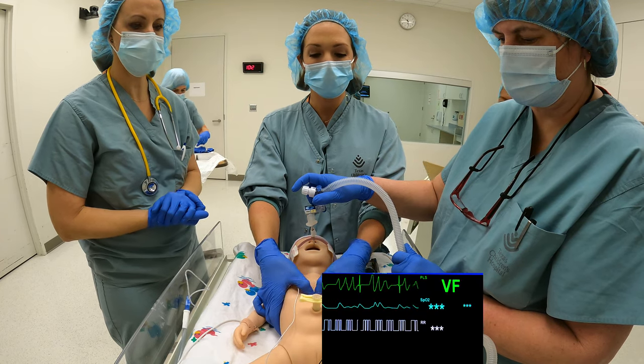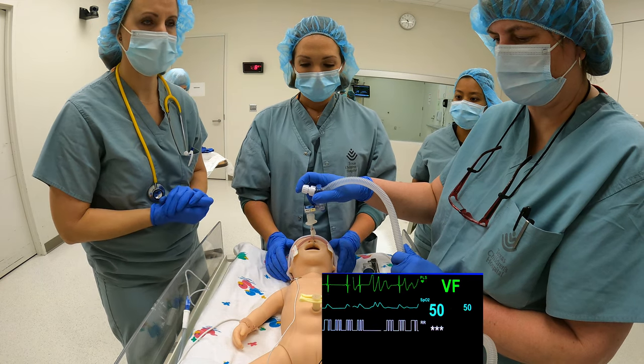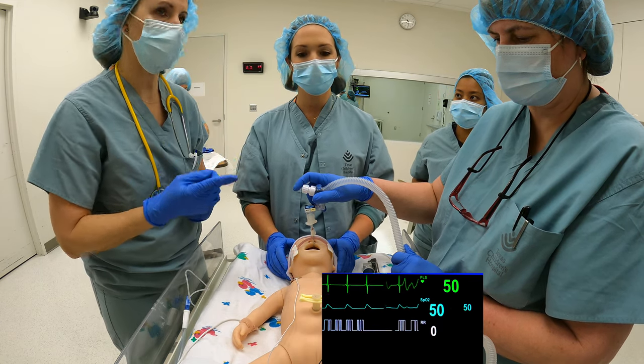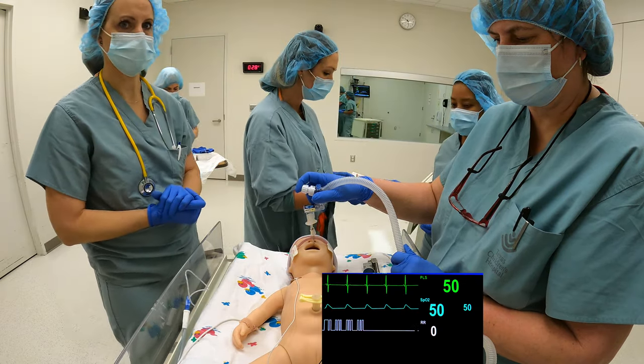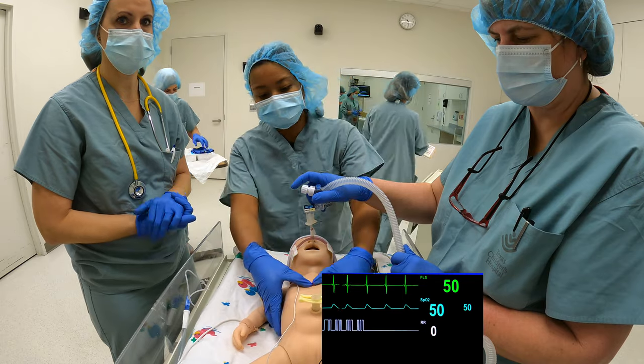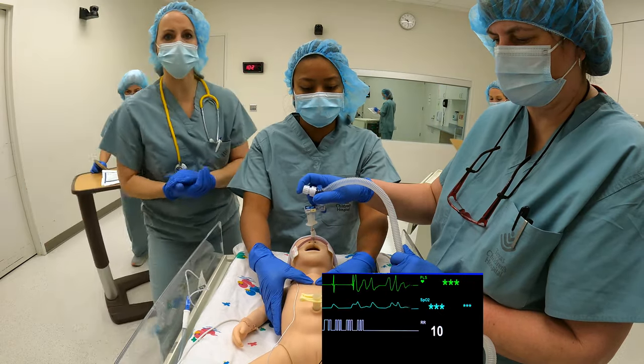It's been 1 minute since we started compressions. Okay, let's pause chest compressions and continue PPV alone. ECG leads are showing the heart rate is still less than 60. Please resume chest compressions. Vanessa, can you switch with me? Jamie, can you please come and place our emergency UVC?